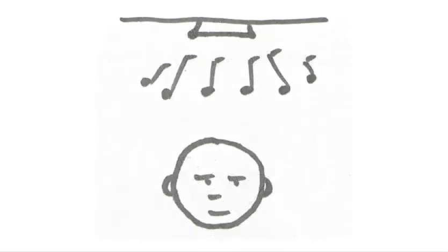During audiometry, we try and test each ear individually. If we take a speaker and install it in the ceiling and present a sound, it's impossible for us to know which ear has heard the sound. Let's say we have a test subject who has really great hearing in one ear and no hearing at all in the other. Let's take this person and seat them in a room. We'll present sounds through the ceiling speaker. The person would respond even if we presented very soft sounds, but we wouldn't be able to know which ear was hearing the sounds and which ear was the non-hearing ear.